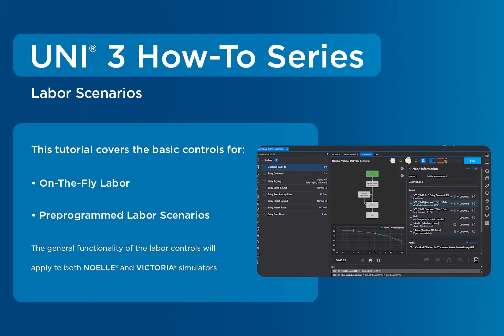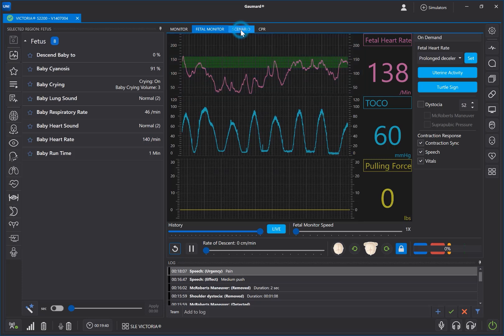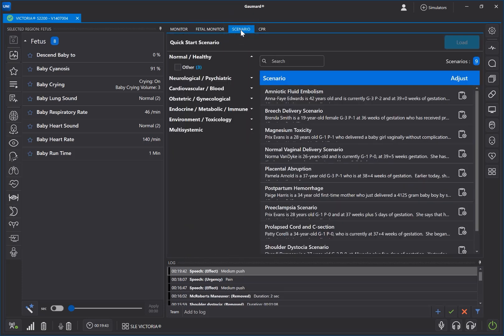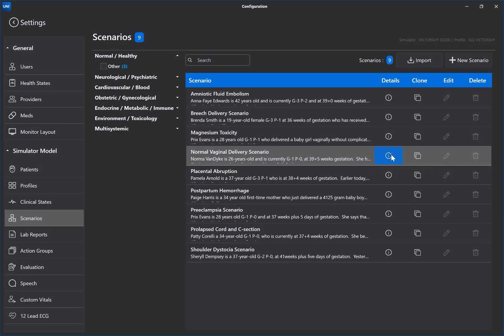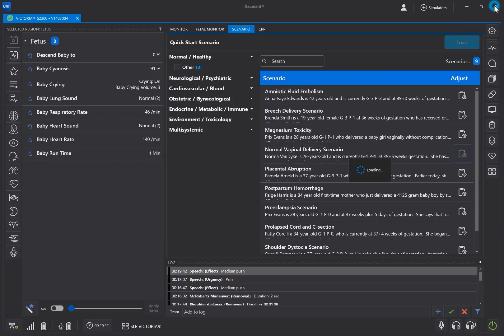Next, we'll cover pre-programmed labors and custom labor scenarios. To load a pre-programmed labor or a custom labor scenario, click the Scenario tab at the top of the screen. This contains the library of simulation learning experience scenarios included with your simulator. To learn more about a specific scenario, reference your SLE Facilitator's Guide or click Manage Selected Item, then click the Details icon. To run a pre-programmed scenario, first click the desired scenario from the list, then click Load.